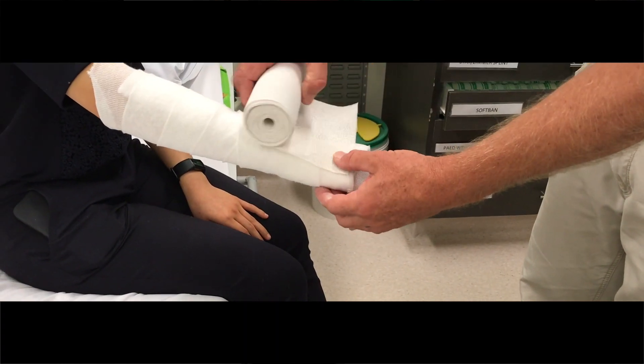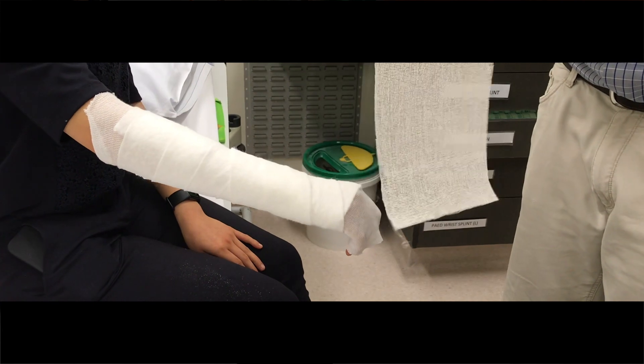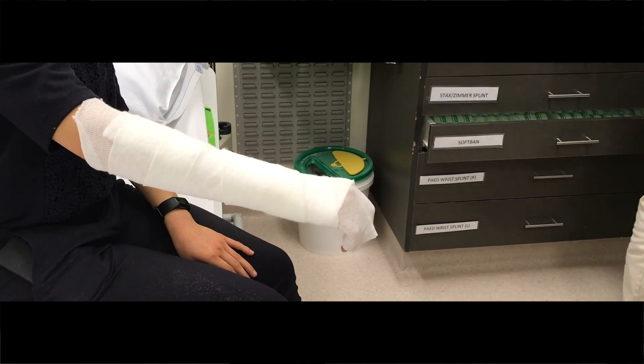Same with the plaster — you want it down to the knuckles because they still want to be able to use their fingers and their thumb. So measure it from just proximal to the knuckles there, and then as high up the arm as you think. So that's about the right length for you.